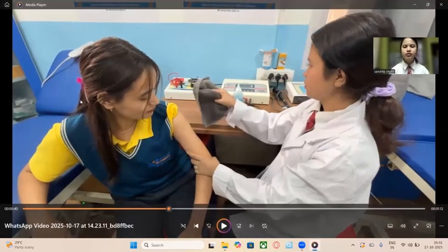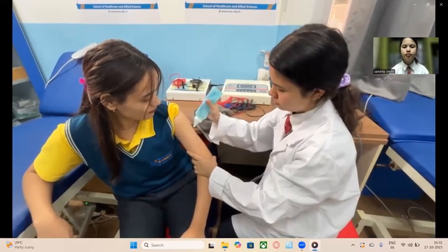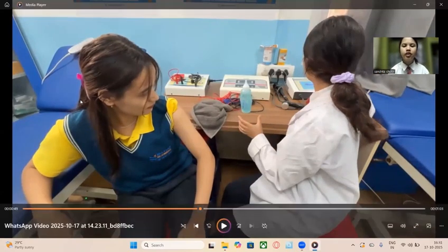Before starting, I checked for any contraindications in my patient, such as open wounds, metal implants, or skin infection. My patient is seated comfortably with the area well supported and the treatment area exposed. I roughly cleaned the area. I am now applying a thin layer of ultrasound gel on the treatment area. The gel helps to transmit the ultrasound wave efficiently and prevents air gaps between the skin and the transducer.